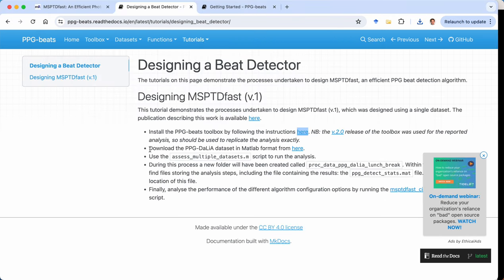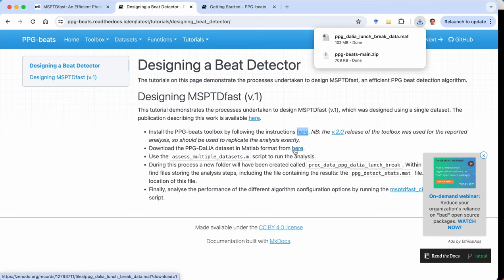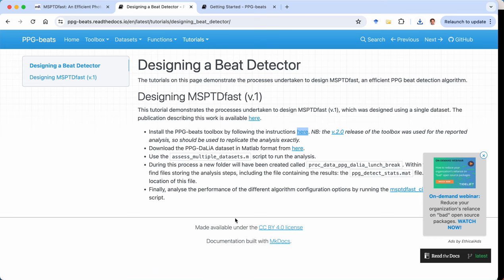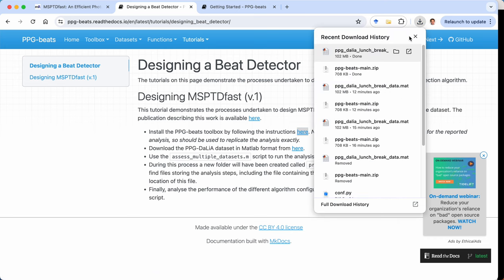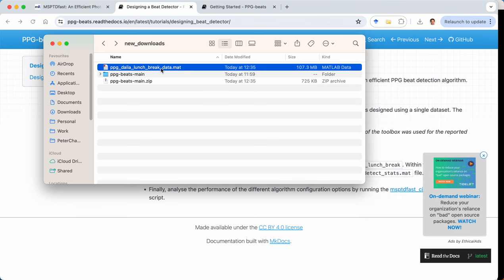The second step is to download the data that we used to design the beat detection algorithm. We used a subset of the PPG Dalia dataset. This is a publicly available dataset that was collected using wearable sensors from volunteers. And in particular we're using the data that was collected during a lunch break. So we now have that downloaded as a MATLAB file.